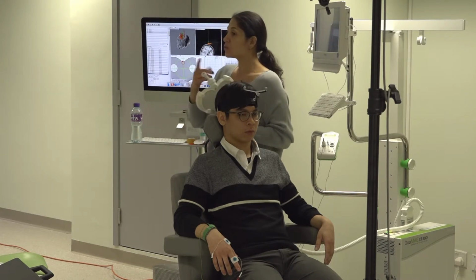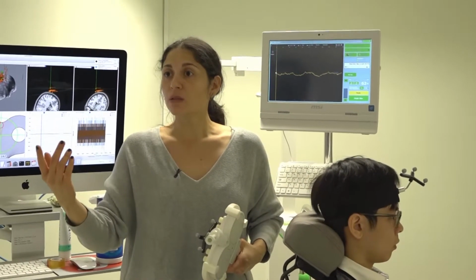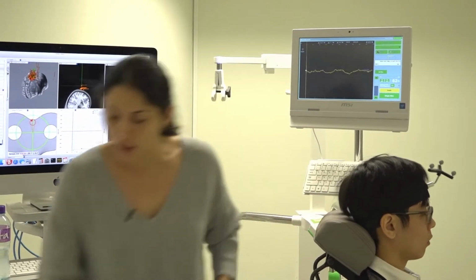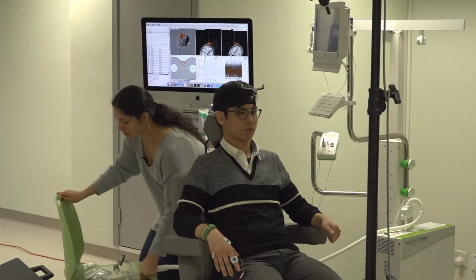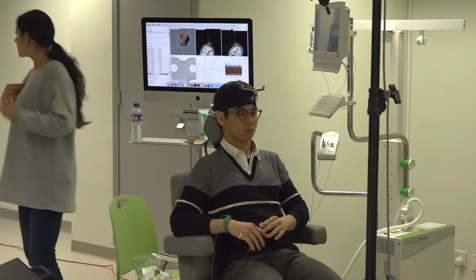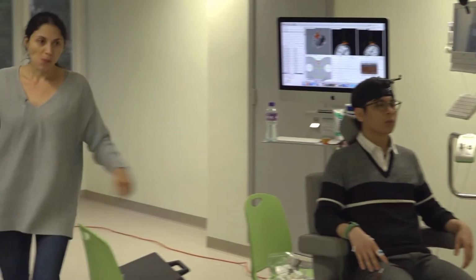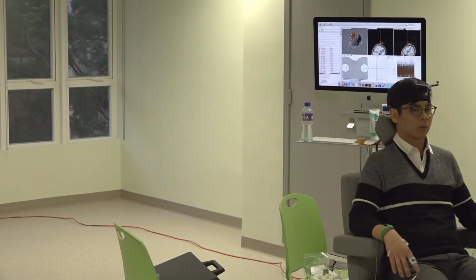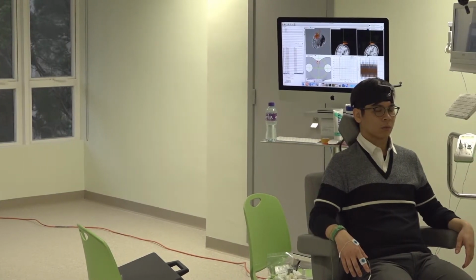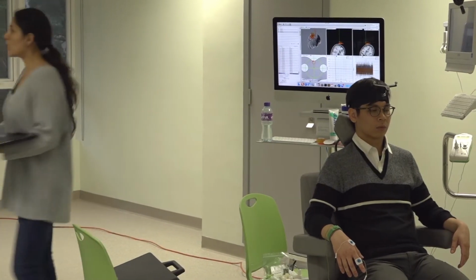Now, this is one way to do it, the traditional way, the way without software, but we have another way to do it, that is with the PES. The software, this PES, I downloaded in my computer, and we can try it there. You can download it in any computer that you want.